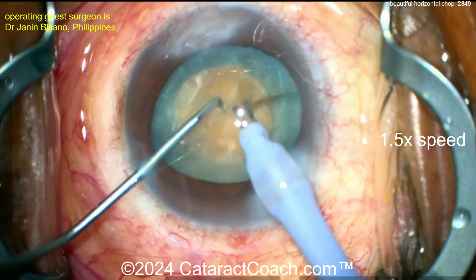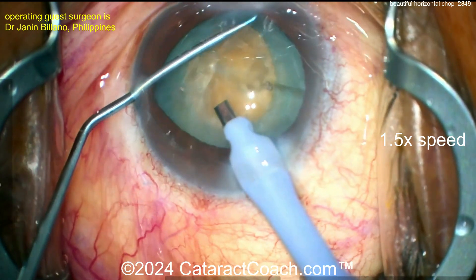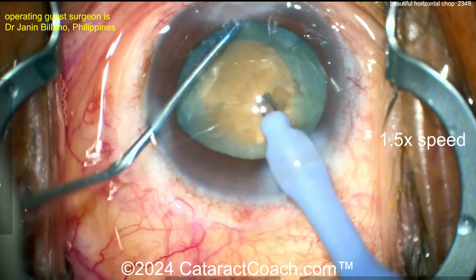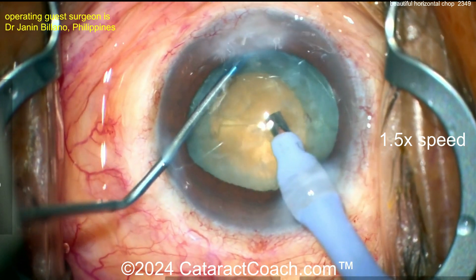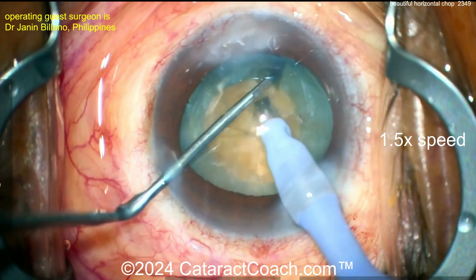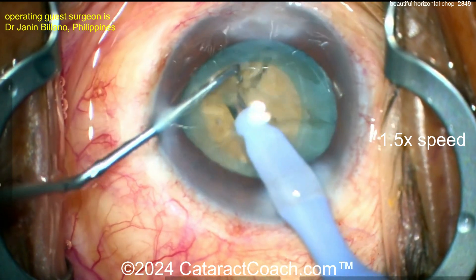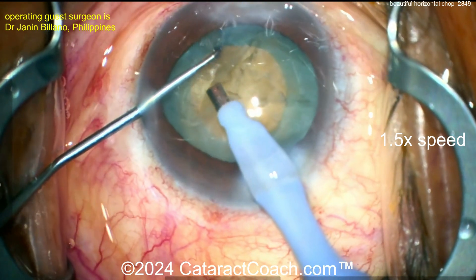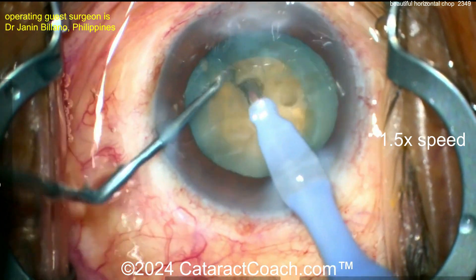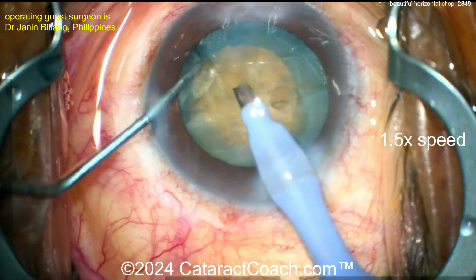Make sure you propagate that chop all the way through. Separate them out, and once you do that, chopper pre-placed again. By pre-placing the chopper, you're making life a little easier for yourself, because when you hit that high window of vacuum — chop right there — you go. Remember with FACO chop, you do have a finite window of time to get the chop done. You need to get that chopper in good position and do the chop action before you lose the vacuum suction holding power of the nuclear piece.